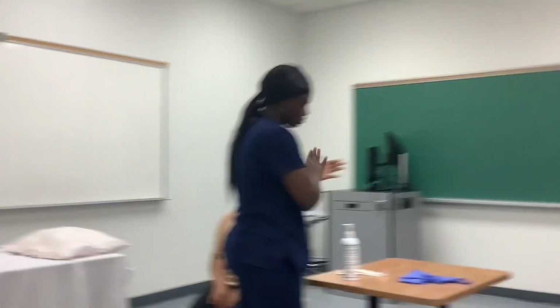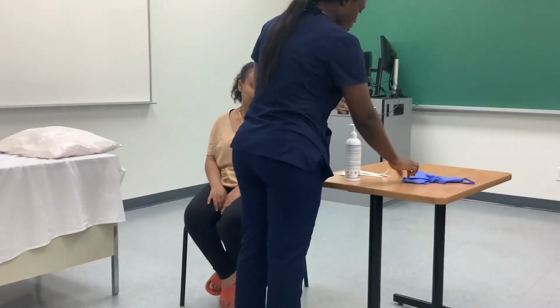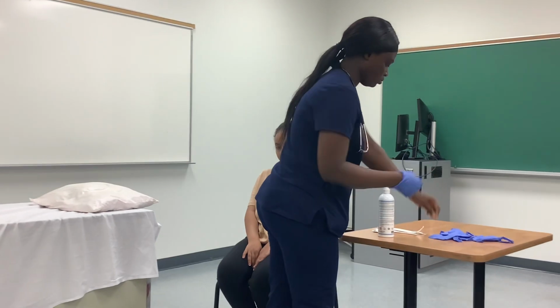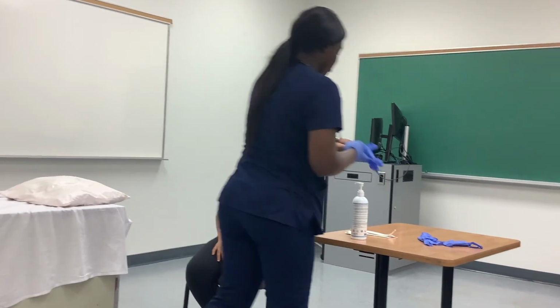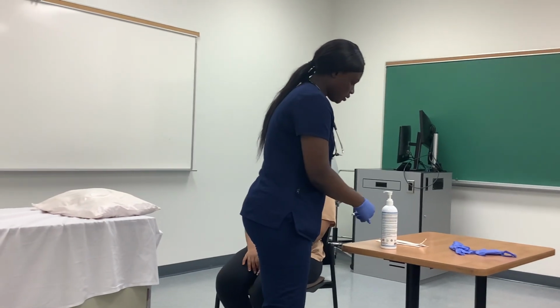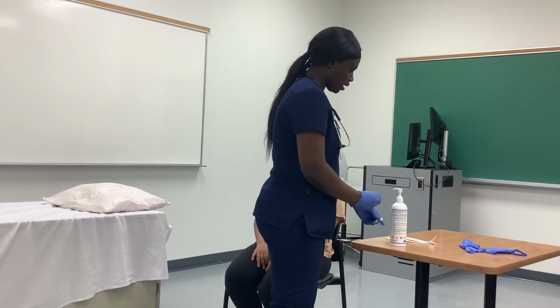Digital assessment. Here is my student ID. My friend is recording. She will do a 360 of the room. Okay, I'm gonna do my hygiene. And my gloves. I'm gonna clean my stethoscope, both the bell and the diaphragm.